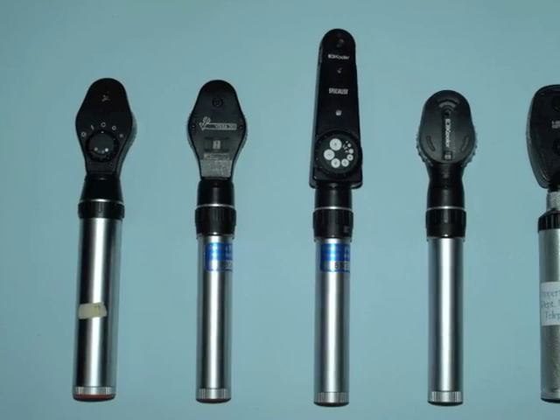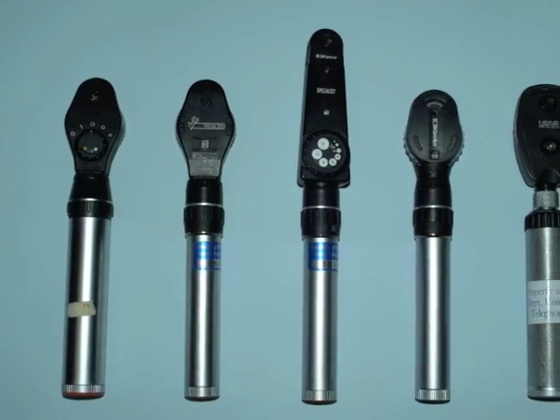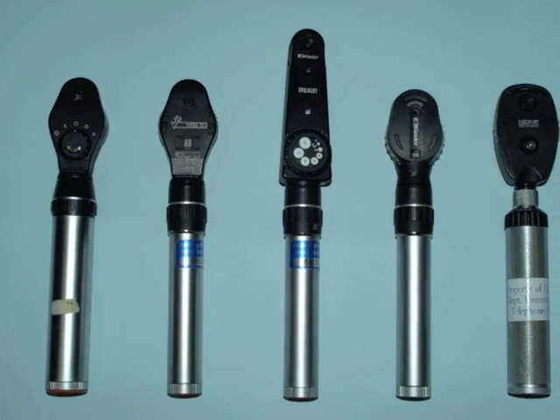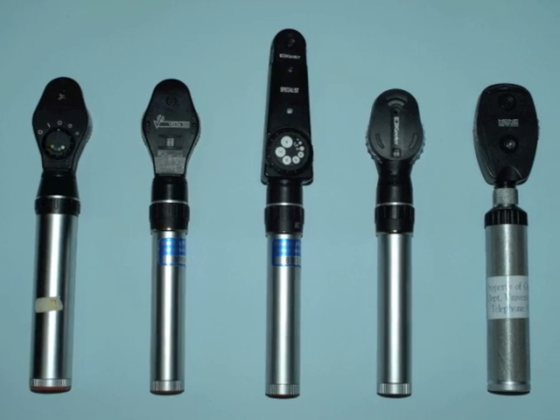Welcome to this video tutorial on using the direct ophthalmoscope for OpticDisc.org. Here we will discuss the anatomy and function of a direct ophthalmoscope and will then take you through the procedure for using the ophthalmoscope. There are many different types and designs of ophthalmoscope; however, it is important to note that these all have essentially the same controls and method of use.